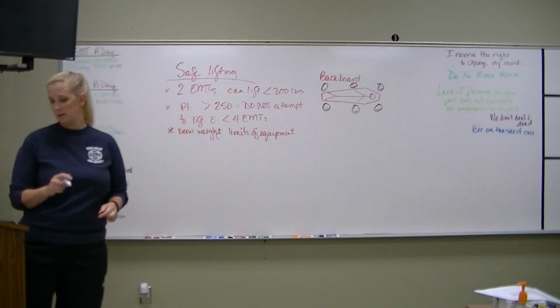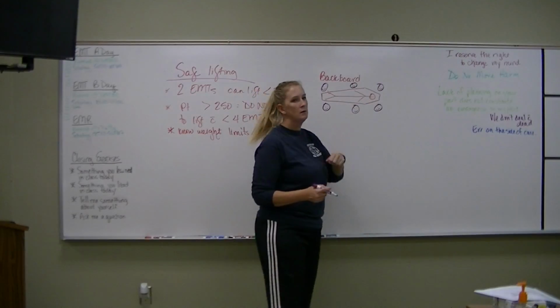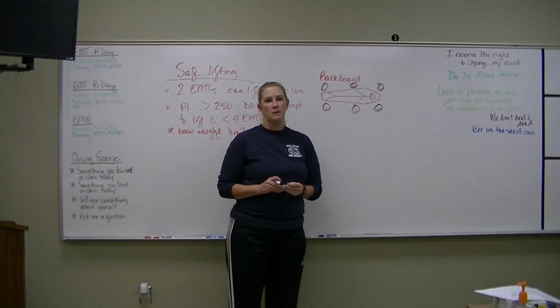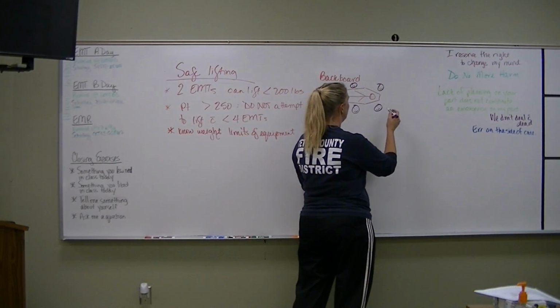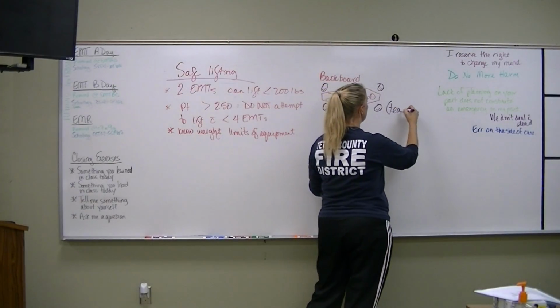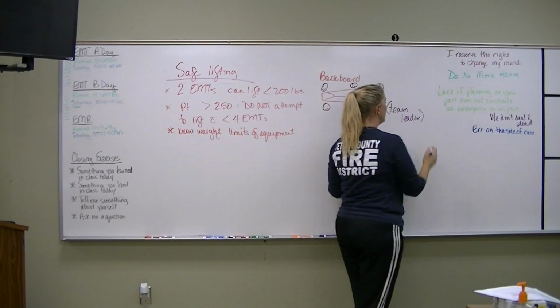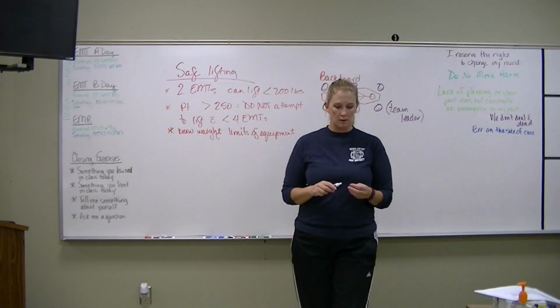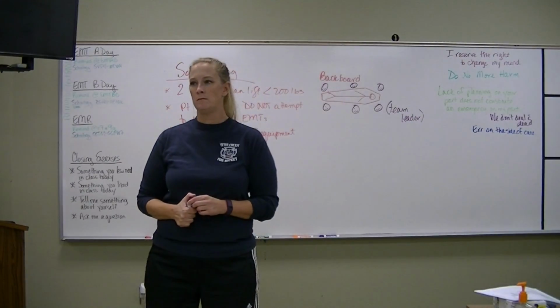Team leaders. Who's the team leader in this setup? Person at the head. One of the people at the head, right? I believe it's supposed to be the person on the right. Yeah, right and head. Okay, so we have our team leader right here. What does our team leader do for our team? Gives commands. What kind of commands can we expect from that leader? Ready, lift. Stop. Ready, lift. Stop. Go. Ready to move.